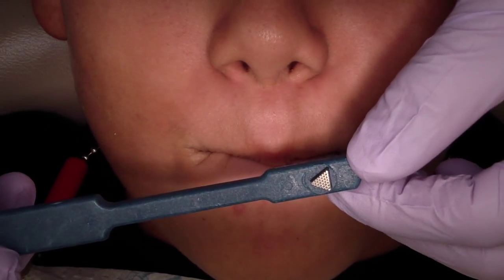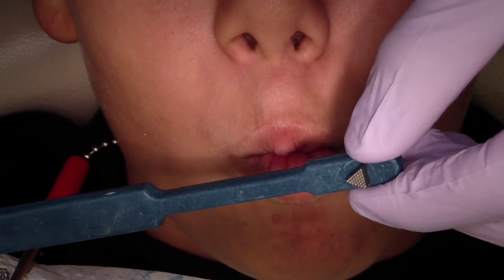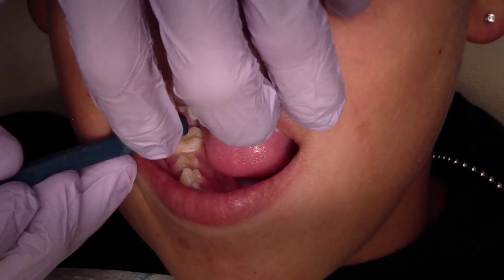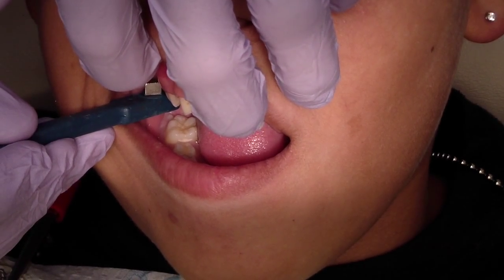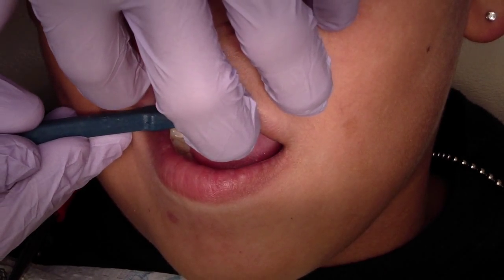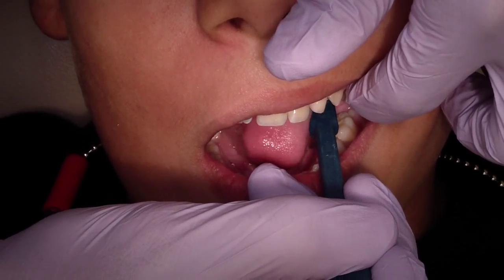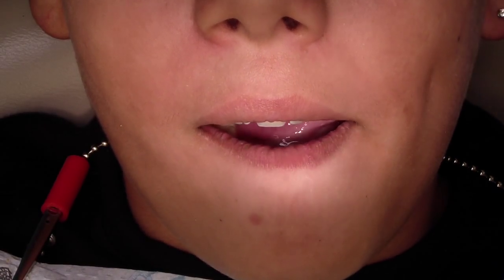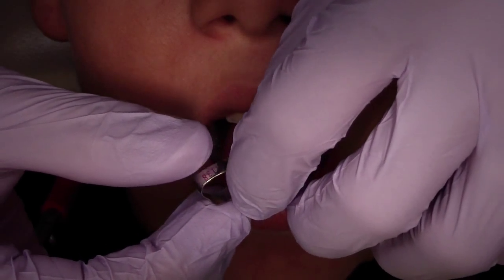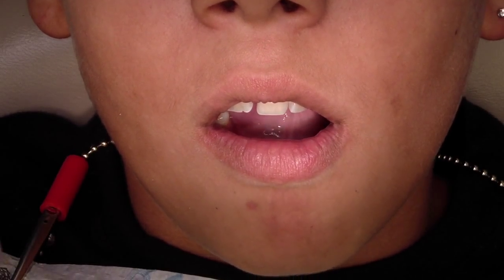We use a bite stick — it's sort of knurled — and also a band seater. We typically put the band down and get the patient to lightly bite down, open, and just do a series of these on both sides. There are a number of different sizes of bands that go up in half sizes. Depending on the company, some are pre-formed, some aren't, and then we seat that around and try as we go.